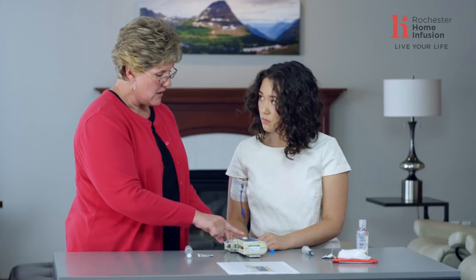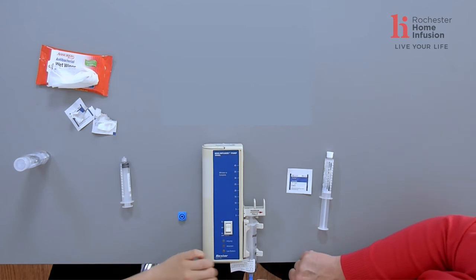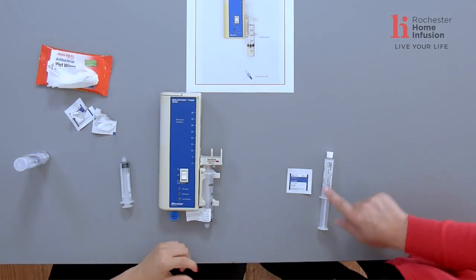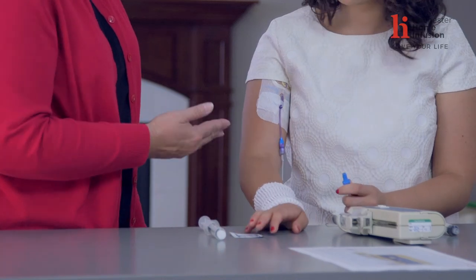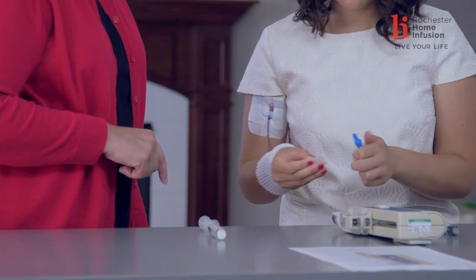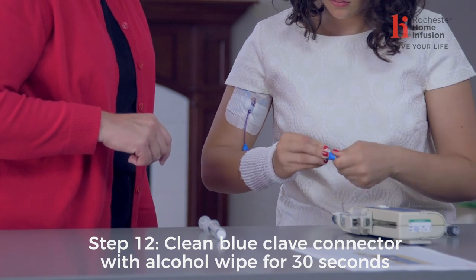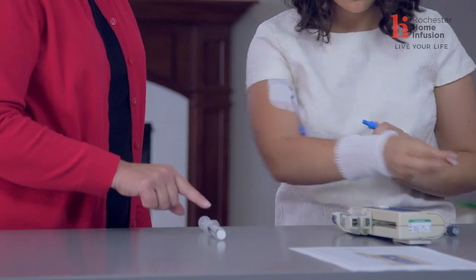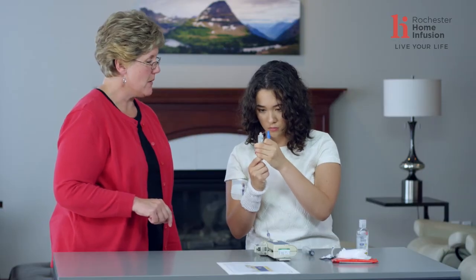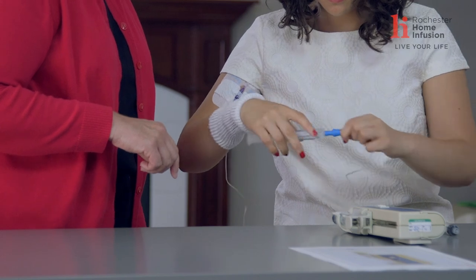The alarm has beeped, so turn it off — we're at the end. Go ahead and unscrew your clave from the syringe and set it aside. Now we need to finish flushing the lines to push the medication all the way through. Take your last alcohol wipe, open it through the middle, lay the alcohol pad right over the end of your clave, wrap it around, and twist and turn for another 30 seconds. When done, grab your last normal saline flush and remove the air until you see a couple of drops.